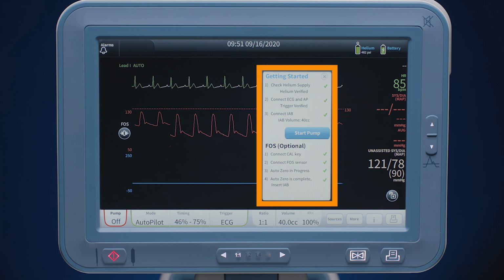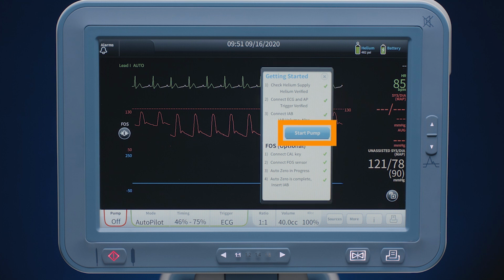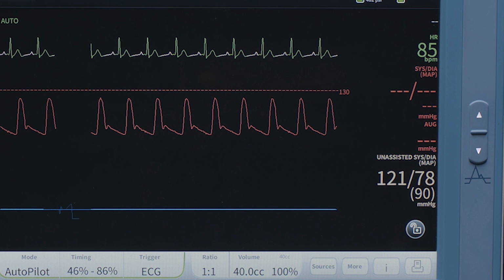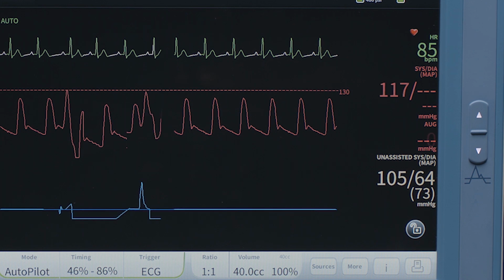Verify that there are all green checks on the checklist. The start pump on the checklist is now blue. Initiate pumping by pressing the Start Pump on the checklist. Observe the console pumping in a 1-to-1 assist.